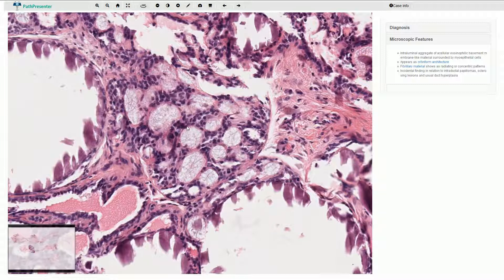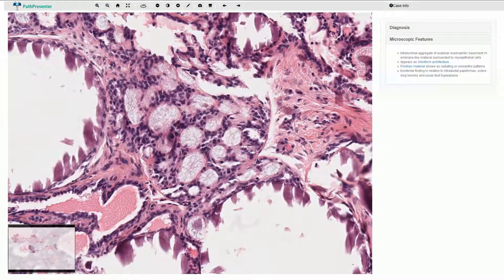Immunohistochemistry is quite helpful. These myoepithelial cells would show positivity for p63. The cells in ductal carcinoma in situ are much more monomorphic and the myoepithelial cells would be seen only in the periphery of the nest.